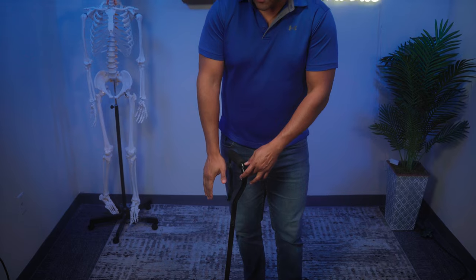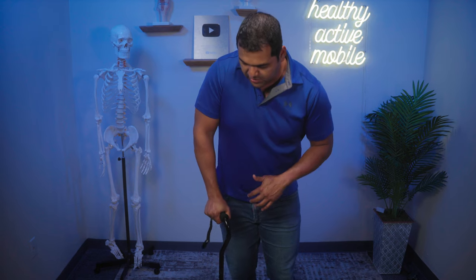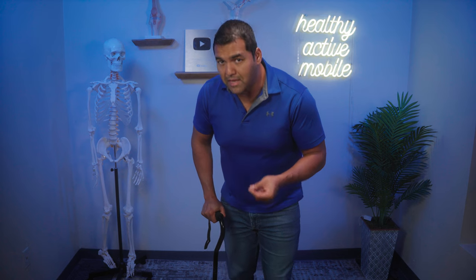If the cane is too low, your body is going to naturally want to bend over to get that leverage and push off, which is not good. You don't want to be hunched over because as soon as you lean forward, your center of gravity will be over or even past your feet, putting you at risk for falling. By having the cane adjusted so you already have a little elbow bend, your balance will be best.